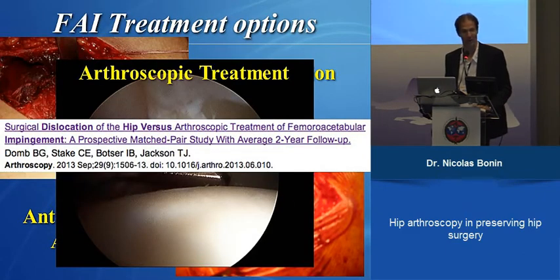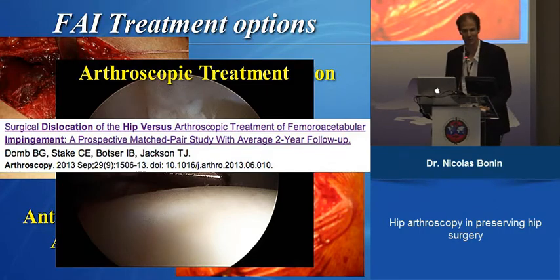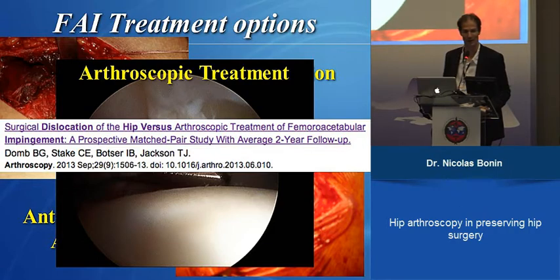So what can we do to treat femoroacetabular impingement? We can go by surgical dislocation, by minimally invasive surgery with an anterior approach, and under arthroscopy. Nowadays, hip arthroscopy has become the leading technique to treat those patients.